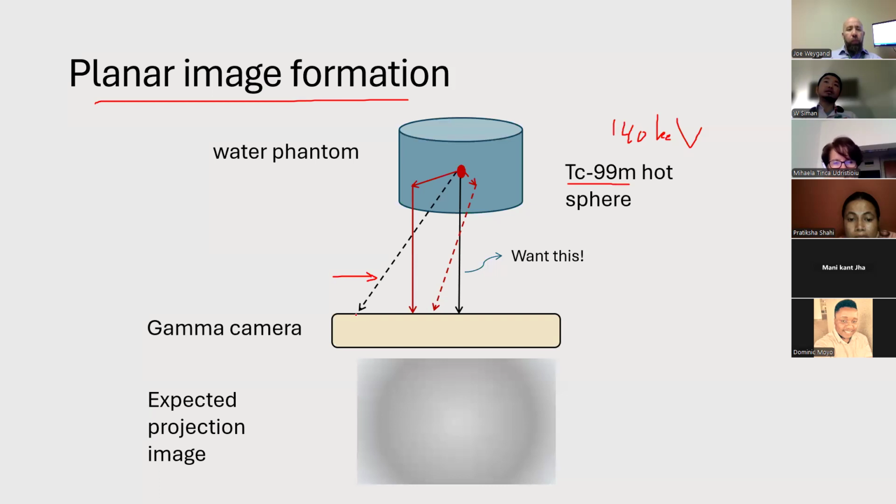The reason is that, let's assume that we have this gamma camera, and you detect the event here. You will have to assume that it comes from somewhere in the orthogonal plane, because you cannot assume that it's from the side. So these are your lines of response. And the second thing is that you have a scatter that comes at an angle and a scatter that comes orthogonal.